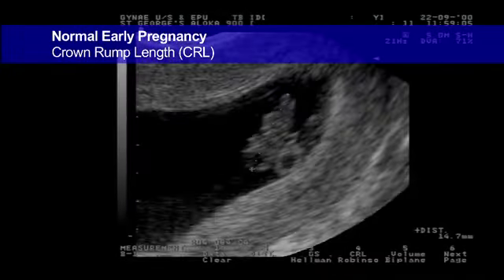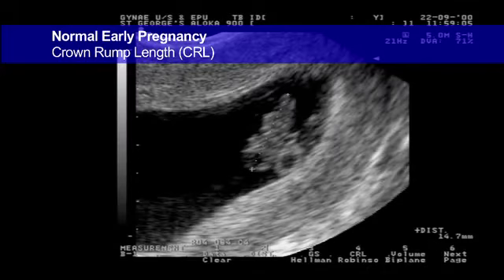We also refer to the crown rump length. This refers to the measurement of the embryo from the tip of the head to the tip of the rump or bottom. And as explained earlier, it's terribly important not to include the yolk sac within this measurement.